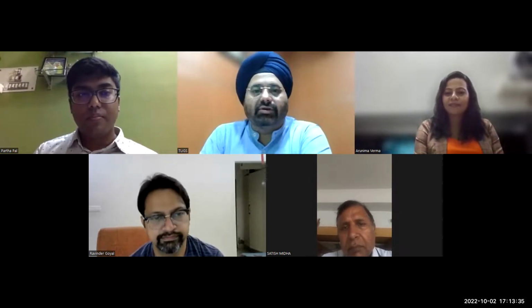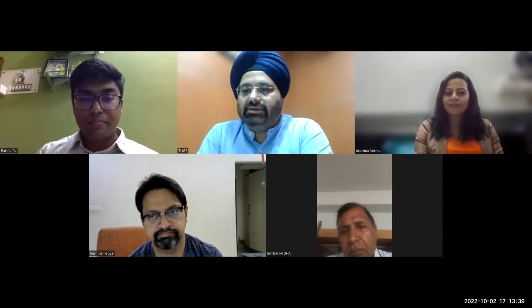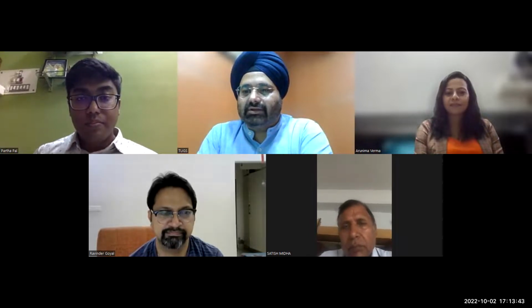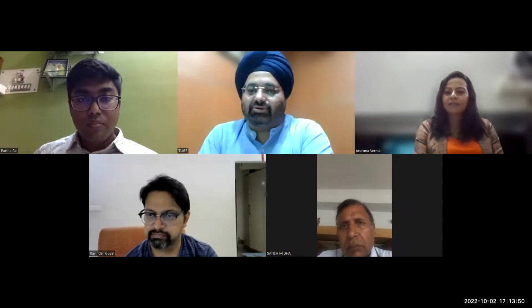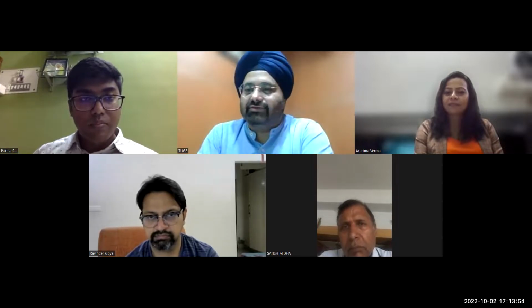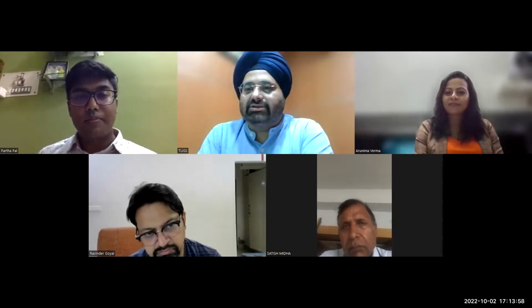Thank you, Dr. Partha. Any other queries or comments from the panelists? Let me just go through the questions. There's a question: which limb of the gastroenteral anastomosis should you put the stent in? I guess that's what he meant to ask. It is obviously going to be into the efferent one. I hope that answers the query there.